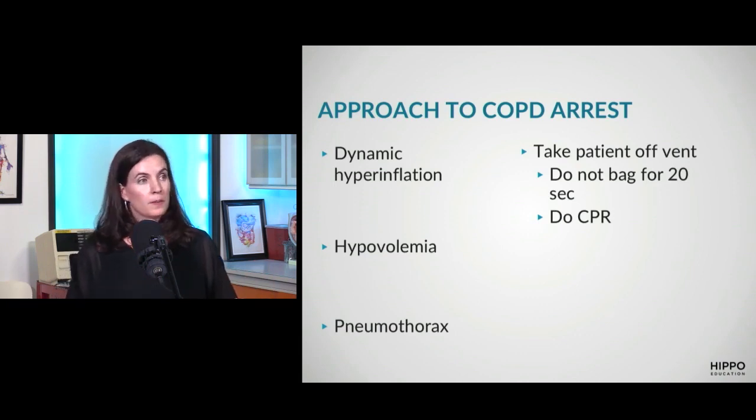So this is something that can be rapidly fixed by holding the bagging and making sure we're actively deflating the lungs. I think that's such an important point, because the natural tendency with everyone on the team is that everyone's doing their job and you're focused on trying to run the code. RT's at the bedside or someone's there, and the natural tendency is always going to be just to bag because they're arrested, so you need to oxygenate, and everyone goes a mile a minute. In all fairness, RTs too are also aware of this, and so we all just want to be on the same page to communicate that this is a COPD or asthmatic patient. I'm concerned about this. Can we try this out? Because otherwise, everyone's just going a mile a minute.